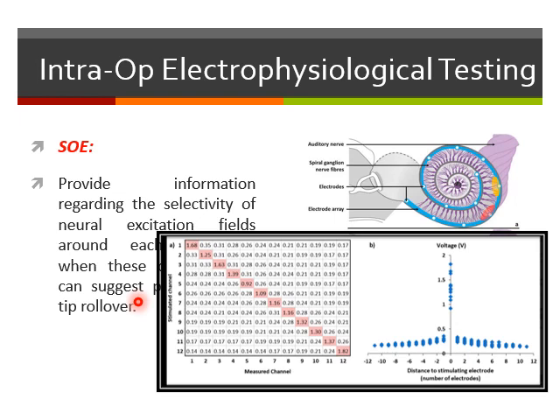Also, this propagation can be captured by the other electrodes around the stimulated electrode. When I measure this captured voltage or captured field from the surrounding electrodes, I can expect that the adjacent electrode might have high overlap, relatively high voltage, and as the electrode moves away from the stimulated electrode, the captured field should decrease, because logically electrode number 12 is far away from electrode number 1.